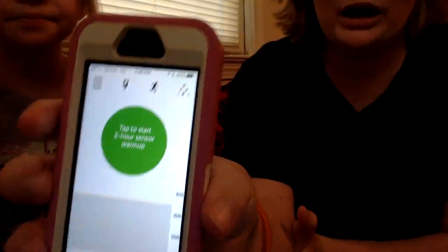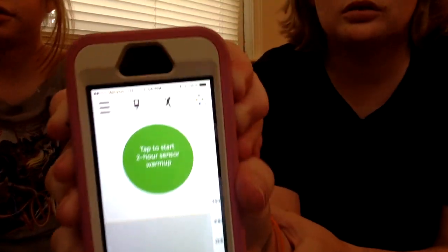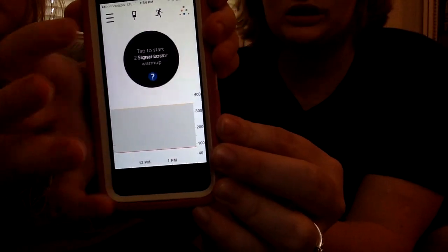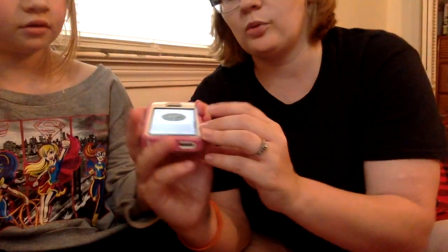You'll take your, we use her iPhone, but you also have a little transmitter thing that comes with it. Hold on. Hold it right here. And you're going to tap, go ahead, tap it. You're going to tap where it says 2-hour sensor warm-up, and her signal was lost before. But once it goes back into where it ranges, I'll show you in a minute once it does it, it'll do a 2-hour sensor warm-up. So in 2 hours, we're going to come back and attach it and show you how you calibrate it. So we'll see you guys in just a few minutes.